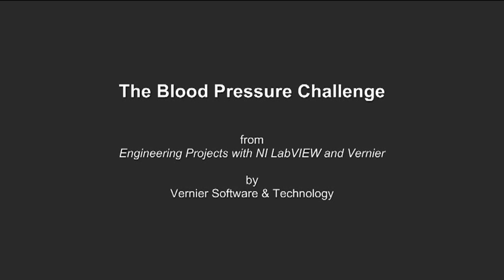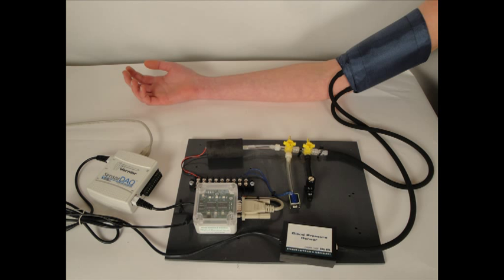Welcome to the Blood Pressure Challenge Project. In this project, we construct an automated blood pressure monitor controlled by LabVIEW.